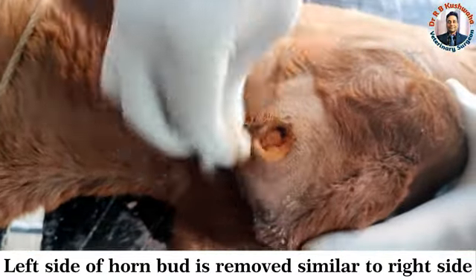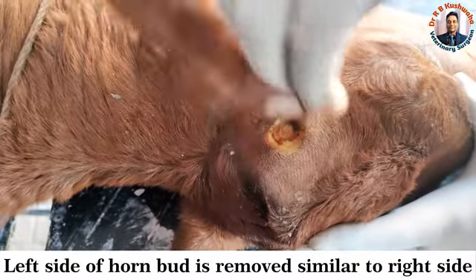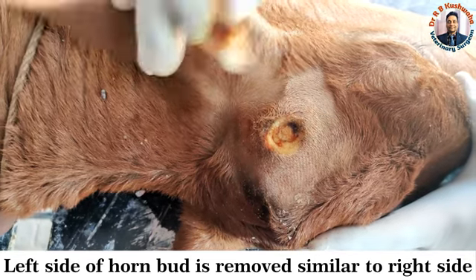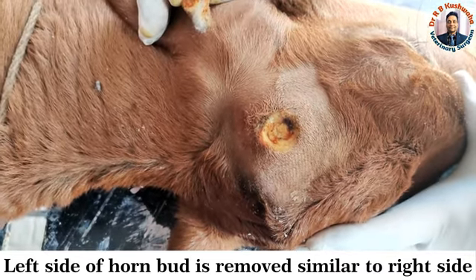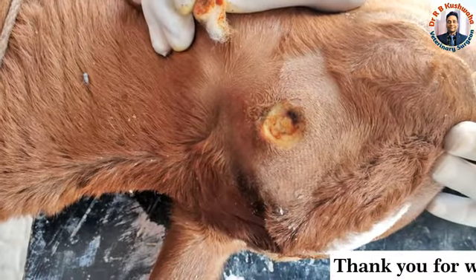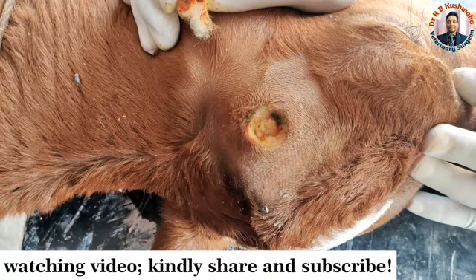We place the disbudder slightly here on the left side. After the procedure, we recommend Hemex and Mend, or any fly repellent such as a topical spray, to avoid fly infestation.